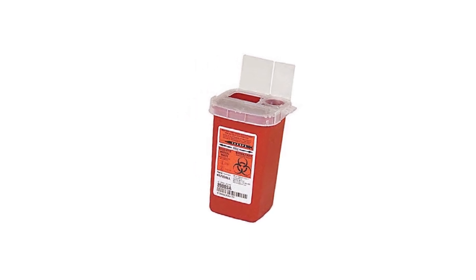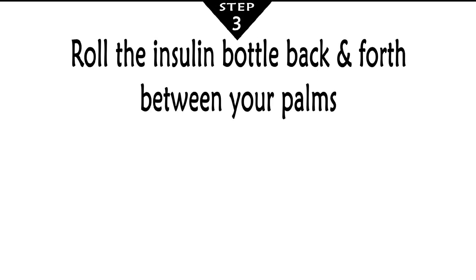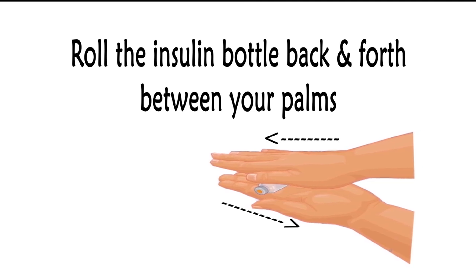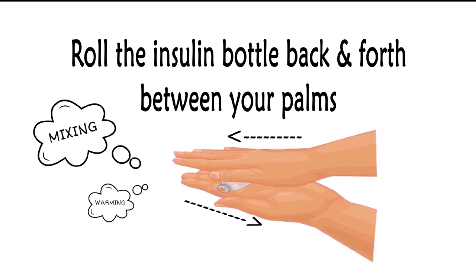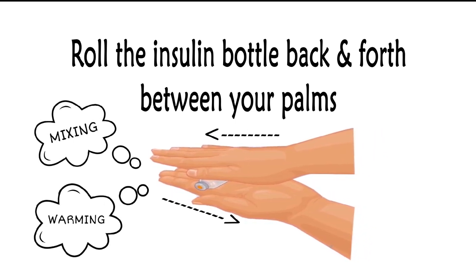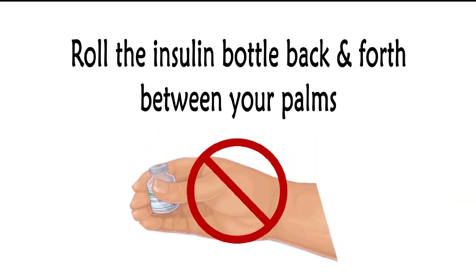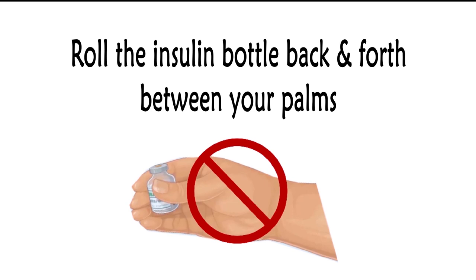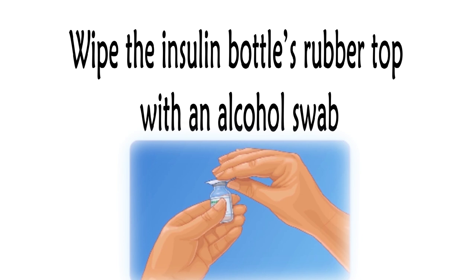A sharps container is used to throw the syringe away when you are done. Roll the insulin bottle back and forth between your palms for at least 10 times. This provides a dual benefit of mixing the insulin and warming it to body temperature to reduce pain when injecting. Never shake insulin — it can make insulin less effective and it creates air bubbles which makes it harder to get the correct dose. For starting to inject, wipe the insulin bottle's rubber top with an alcohol swab.